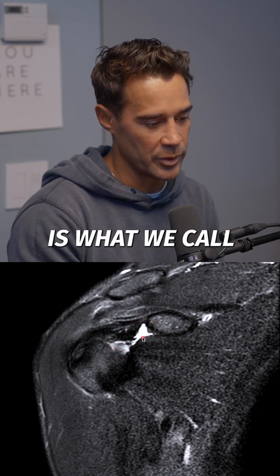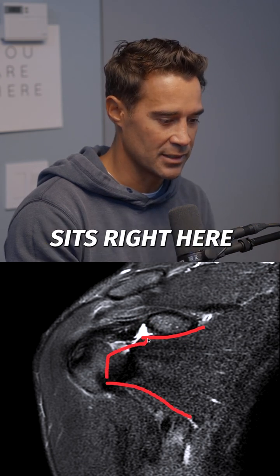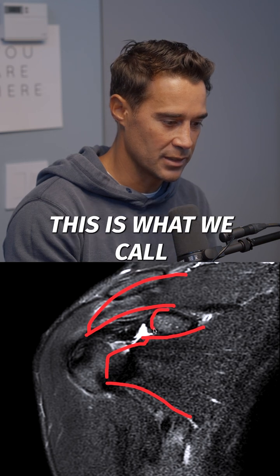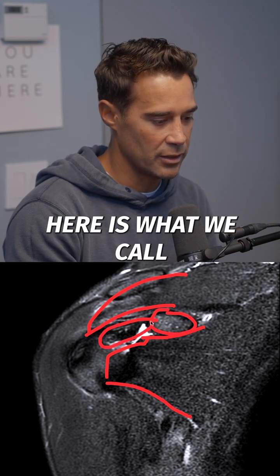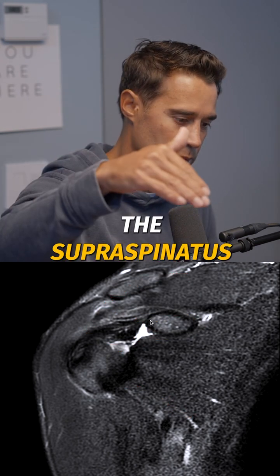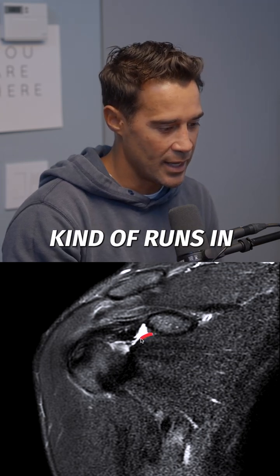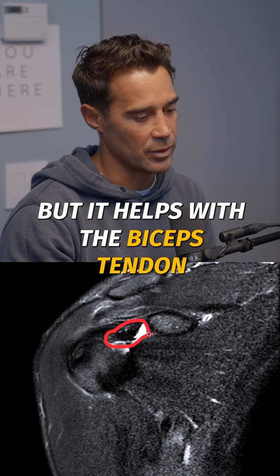This muscle belly right here is what we call the subscapularis — that's the front portion of the rotator cuff as it sits right here — and then the supraspinatus comes over the top. This is what we call the coracoid, and this little window right here is what we call the rotator cuff interval, meaning it's between the supraspinatus and the subscapularis. It's where the biceps tendon runs in, and it's an area of soft tissue that doesn't provide a whole lot of structure but helps with the biceps tendon as it comes into the shoulder.